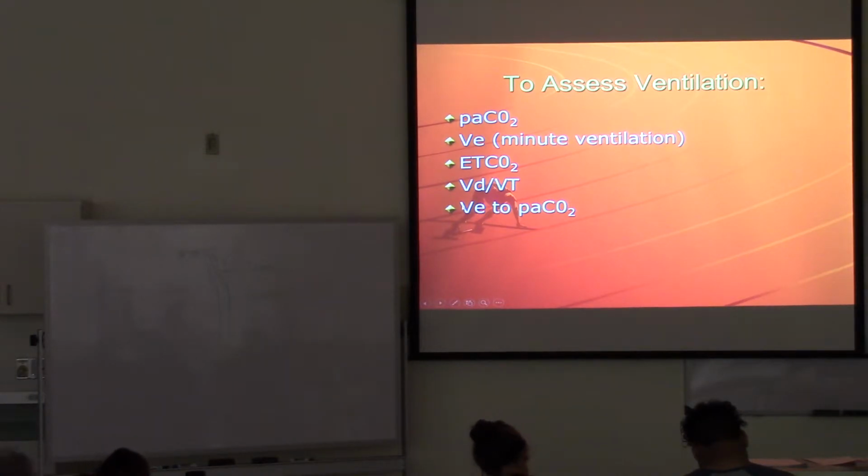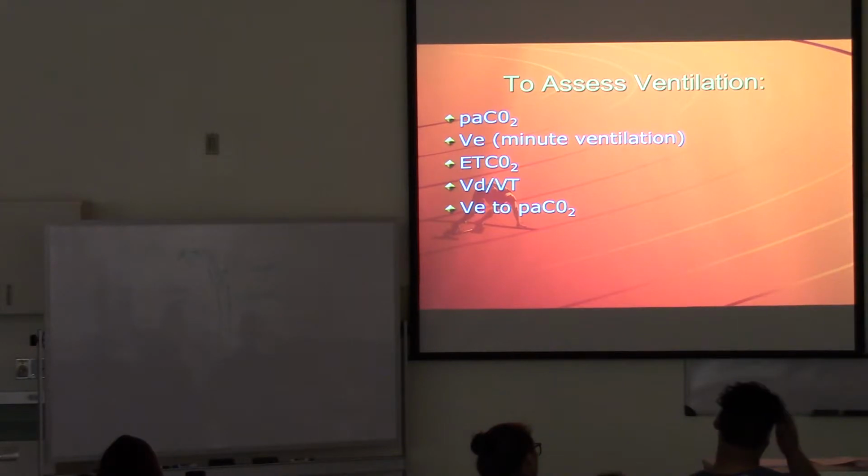We do this a lot. We compare the minute volume to the CO2 and the blood gas. So if the minute volume is, didn't you guys already see this question somewhere? You found a review for the last test and it had that question on there. Patient has a minute volume of 15 liters. And they're breathing fast. Respiratory rate is 30 and moving 500 ml tidal volumes. And this is sustained. And then you get a blood gas and you see that the CO2 is 40. How can the CO2 be 40 if they're moving 15 liters of air in and out of their lungs every minute? VQ mismatch? Yes, a lot of VQ mismatch going on in the lungs.